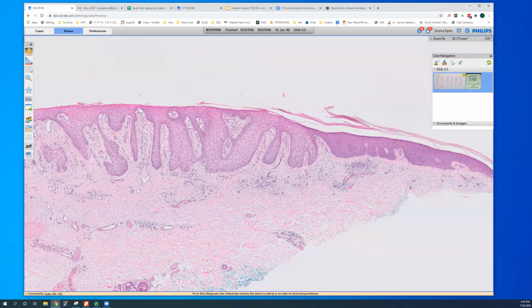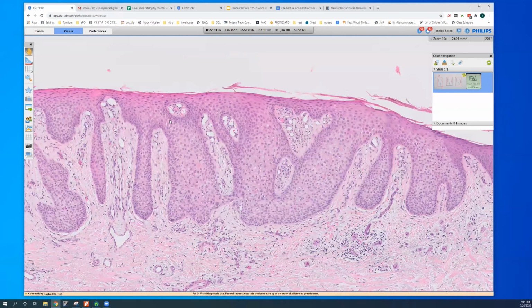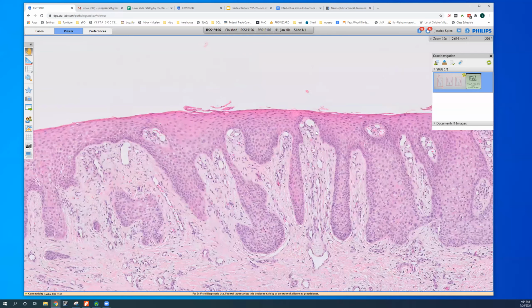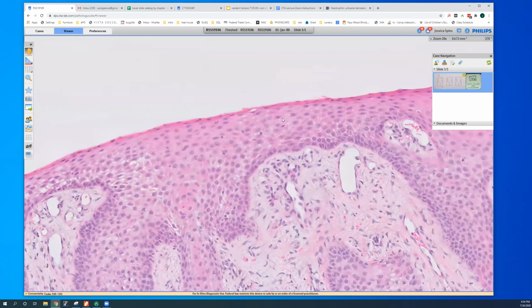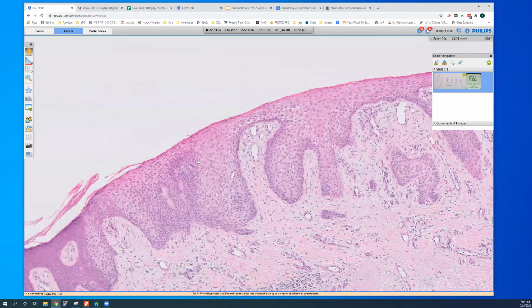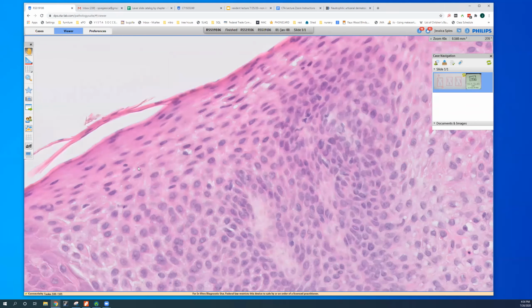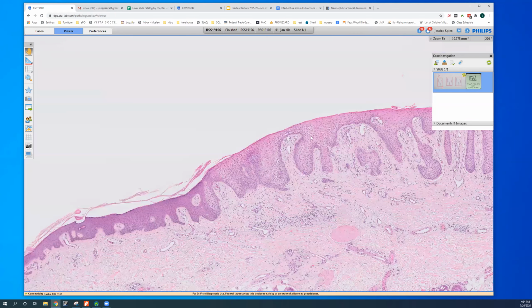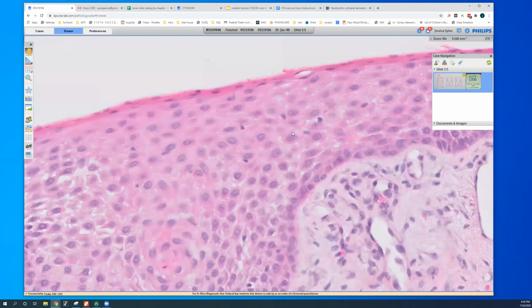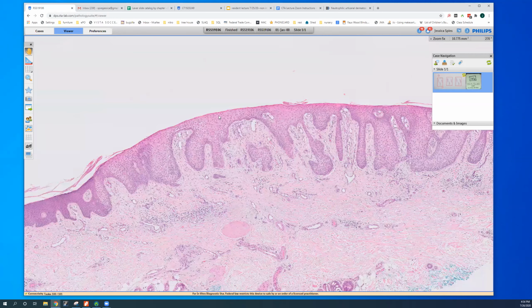Very good. A clear cell acanthoma. Yeah. And what they say is usually you have neutrophils percolating through here. I sometimes find it hard to find them, truthfully. Maybe if we look really hard, maybe we can't really find them. They're often there, but sometimes they're just not, and they're not required for the diagnosis.